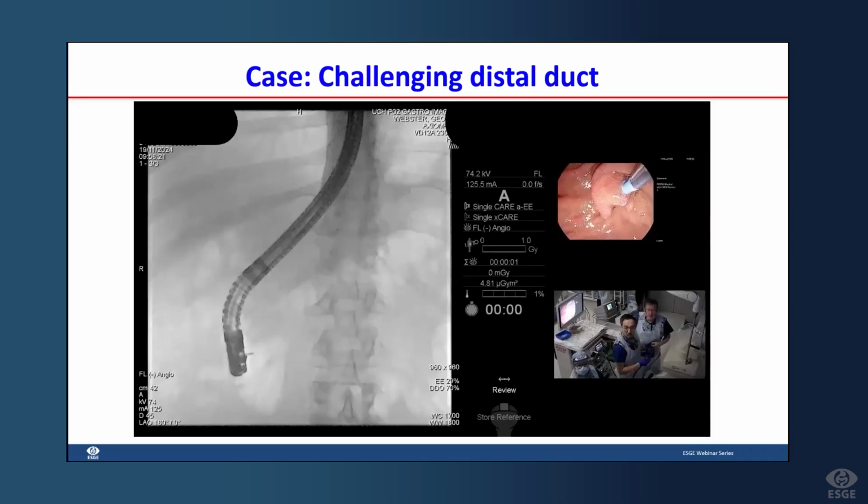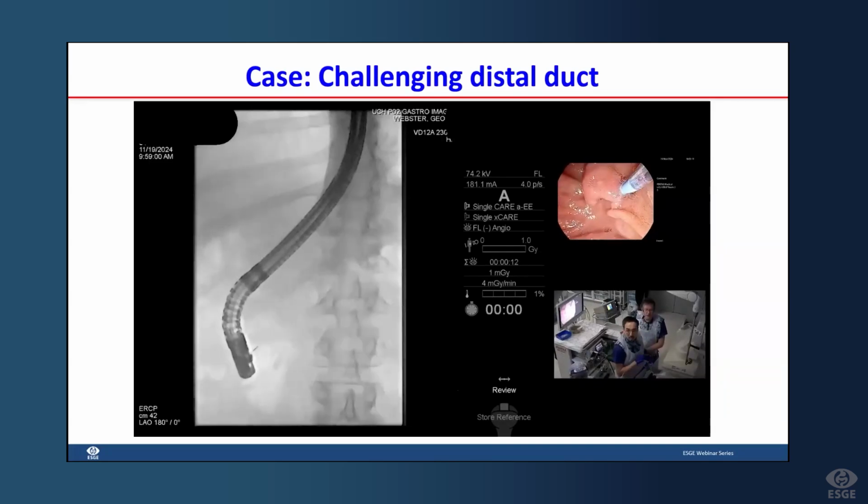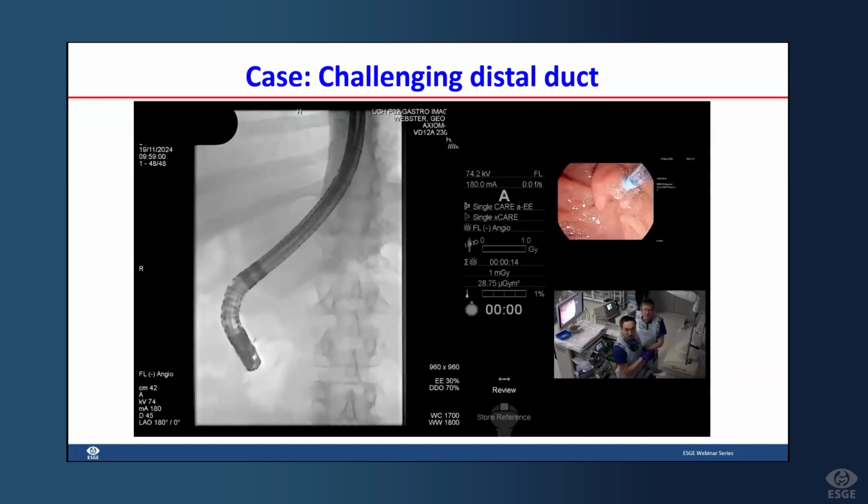Let's move on to a case that we just had a week or so ago in our unit, but I think covers another topic. Here we are, doing a procedure with Heng, one of our excellent new fellows. It's a patient with bile duct stones on MRCP, and looking to clear.